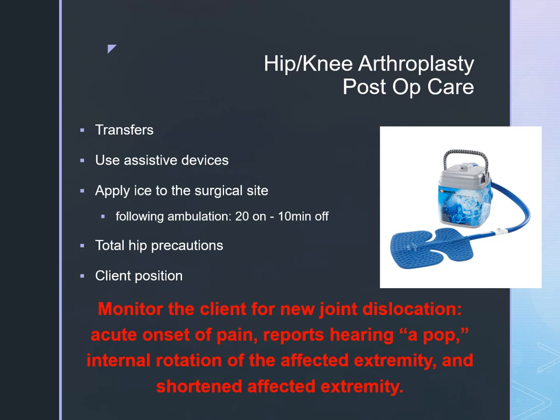When we're using the assistive walker, make sure that they are sitting down, they have their balance, they're not feeling woozy. Once they're stable, you usually have one hand on the walker handle and then one arm is on the bed pushing themselves up. Never have both hands on the walker at the same time to rise. They're going to pull the walker on themselves.